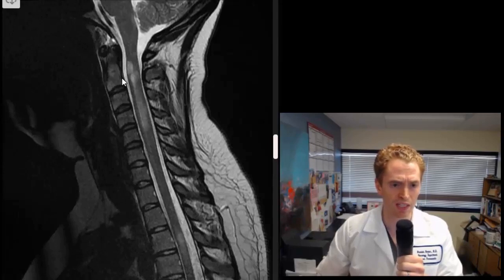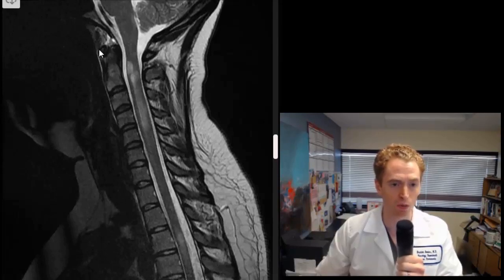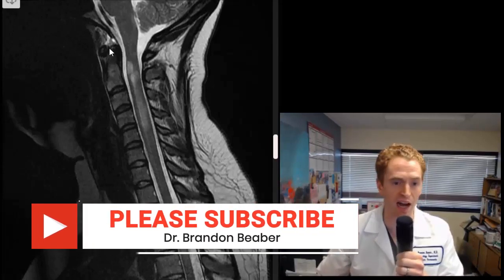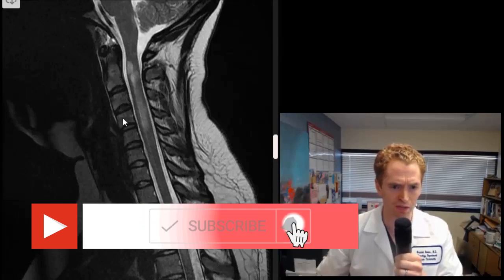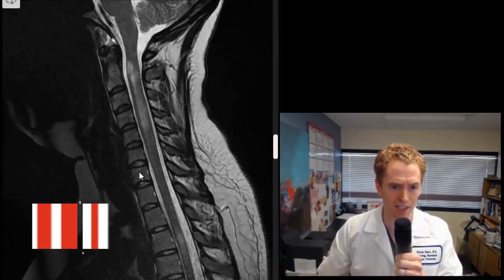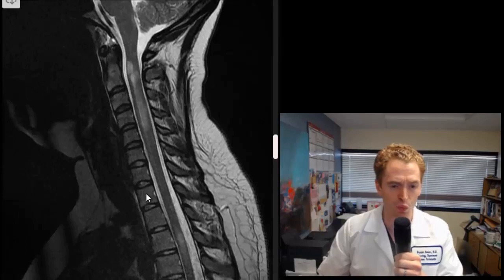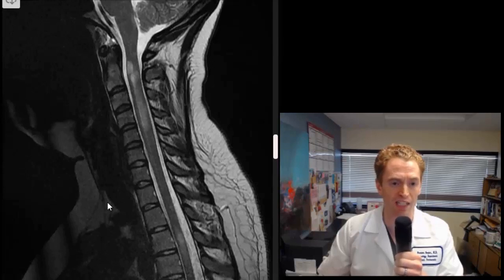This is C2 and the odontoid process that extends up, and these two structures are part of the ring that forms C1. That anatomical arrangement allows you to turn your head side to side. So you can see the vertebrae: C2, C3, C4, C5, C6, C7, then T1, T2, T3, T4. Even though this is an MRI of the cervical spine, we can see some of the thoracic vertebrae.